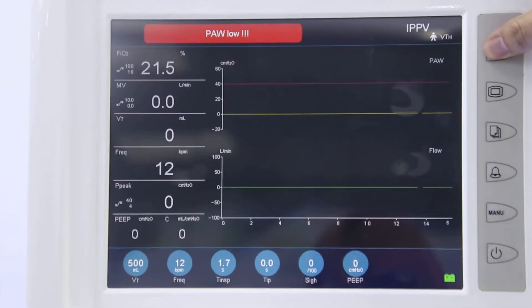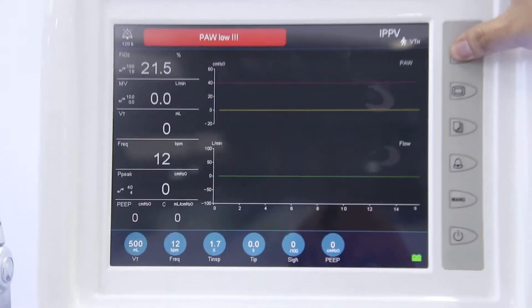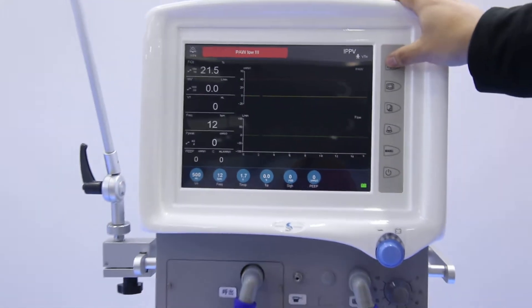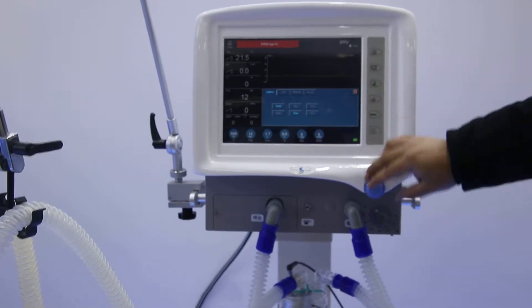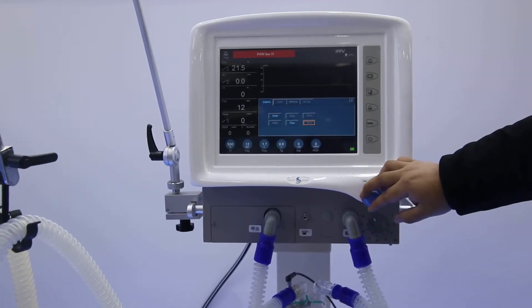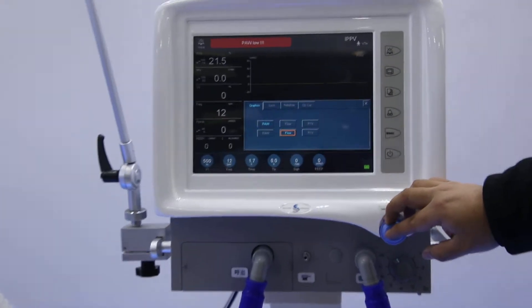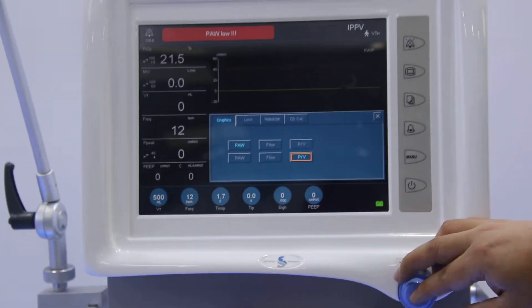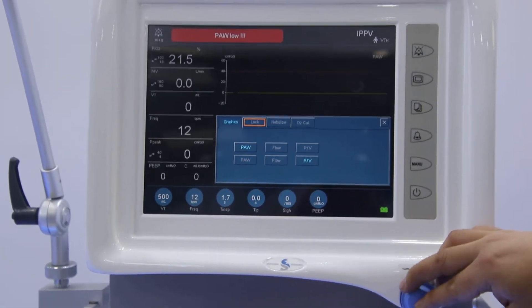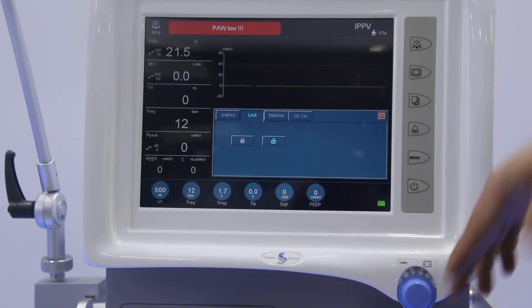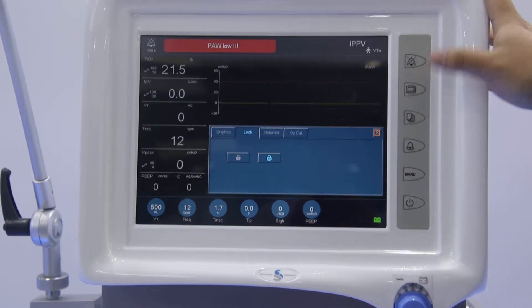The first button here is the mute button. Once we press this button, the machine will be in silence for two minutes and then it will recover again. And the second button is for the graphics. As I mentioned, you can choose each one of them to change it to the PV loop. And the third one is for the lock. Once we lock the machine, then the buttons cannot be used.